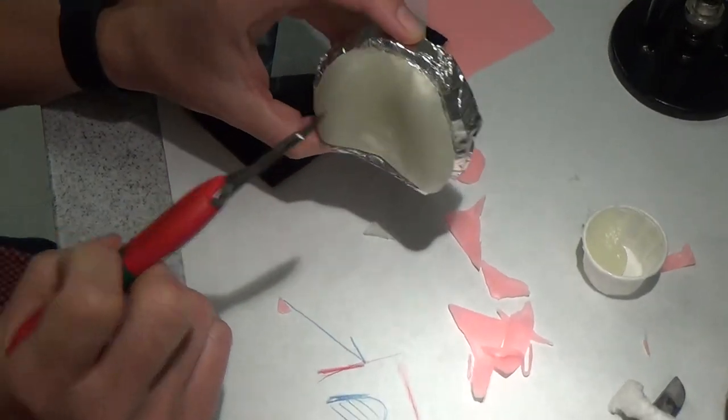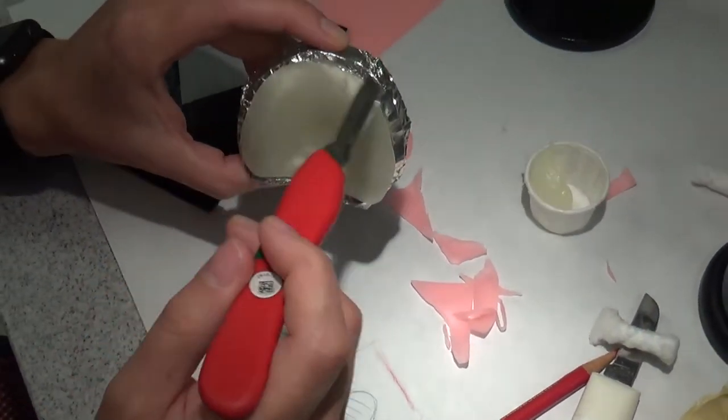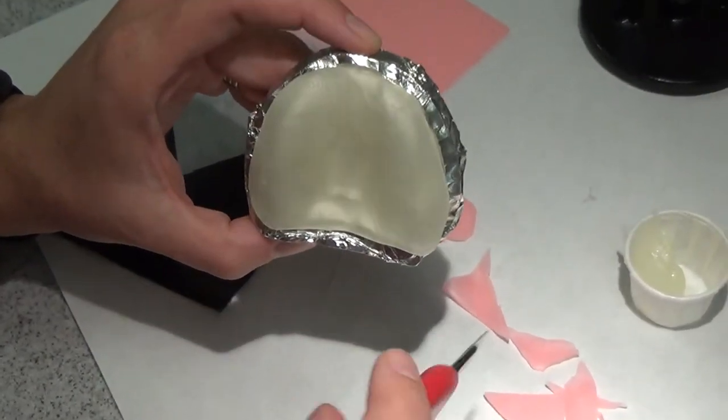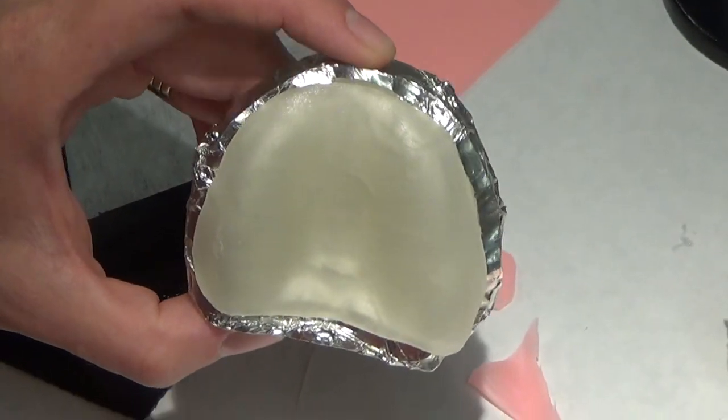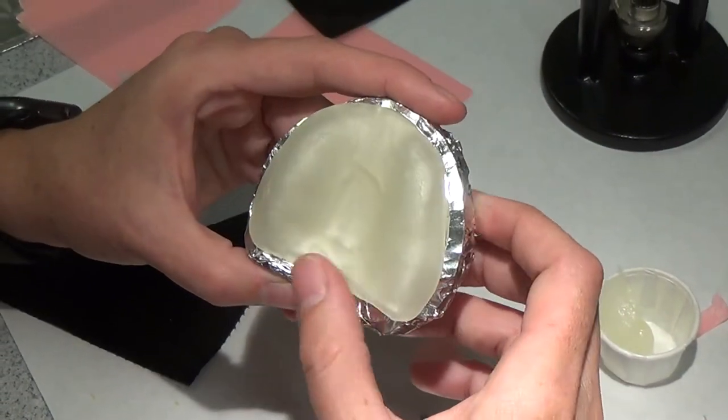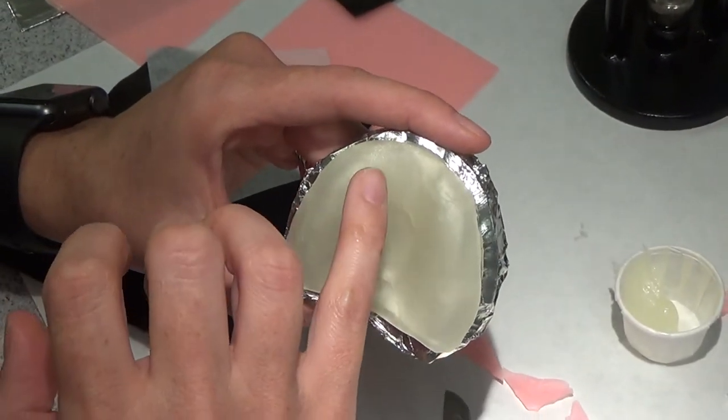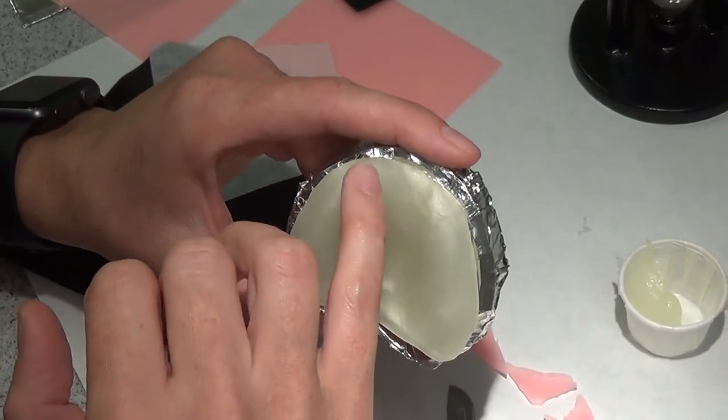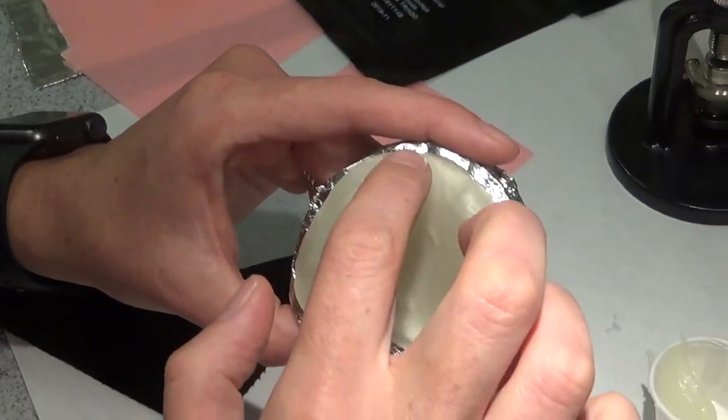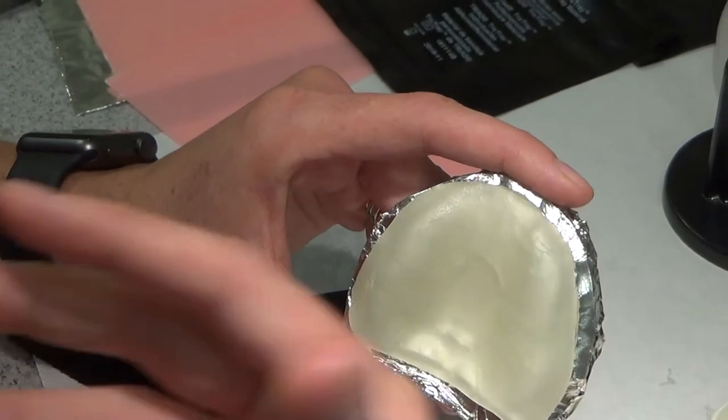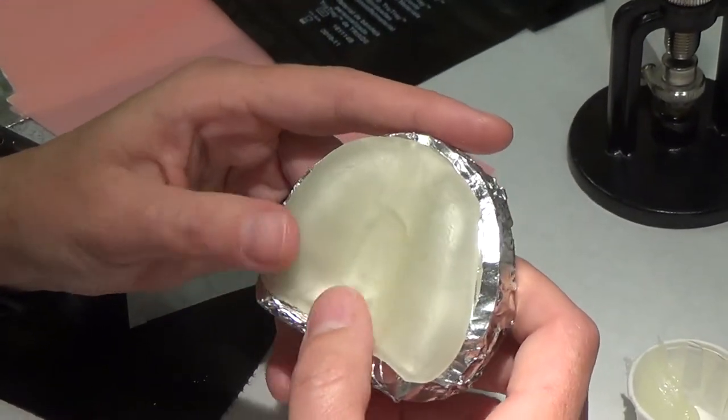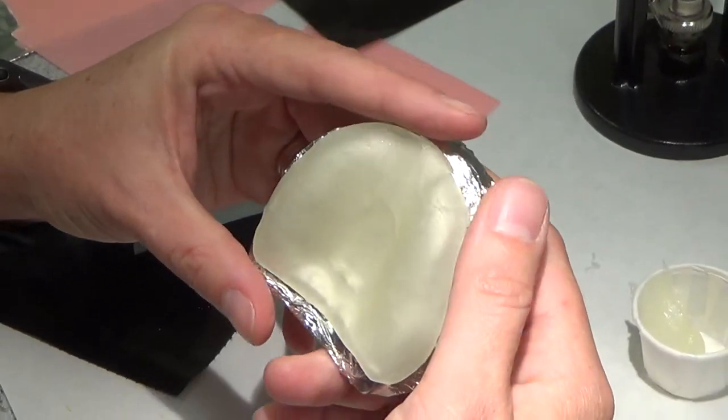This particular patient has no bone in this area. So I'm going to make a modified type of impression. Remember in lecture, I said make sure you design your tray for the type of impression that you plan to take or make. So I'm going to make a combination impression where I do a passive impression in this area with light body and then medium or heavy body everywhere else. I need to have access to this area. So this doesn't have to make sense to you right now. We're going to try to actually record the act of this impression so that it'll make more sense.